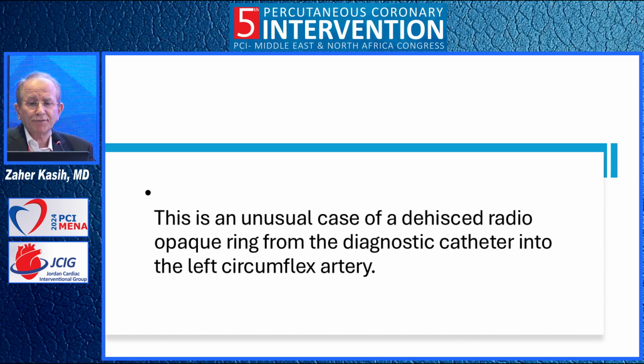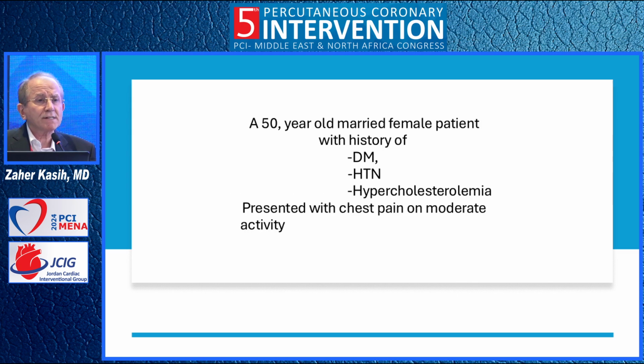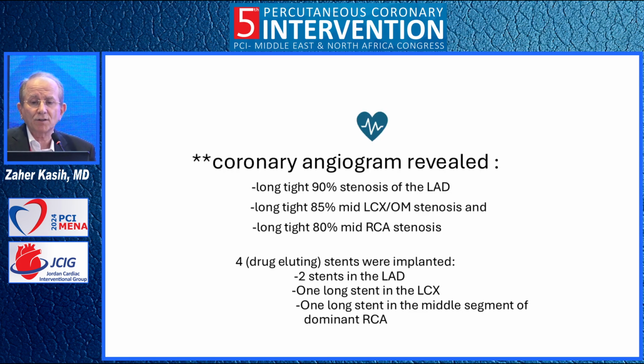Now, coronary angiography is the gold standard for diagnosis of coronary artery disease. Though it is a relatively safe procedure, complications can occur. Most complications occur during angioplasty and stenting, as the procedure involves manipulation and traction forces. This is a 50-year-old married female patient with a history of diabetes, hypertension, and hypercholesterolemia. She presented with chest pain on moderate activity.